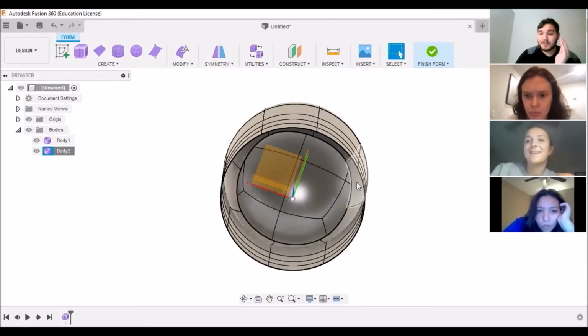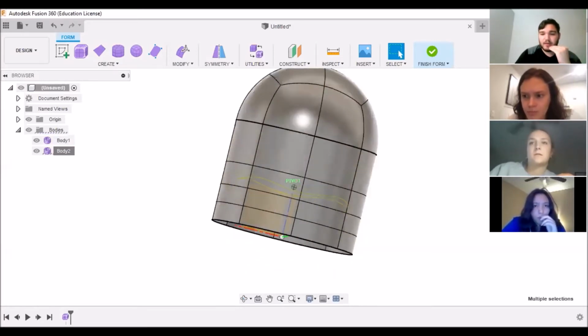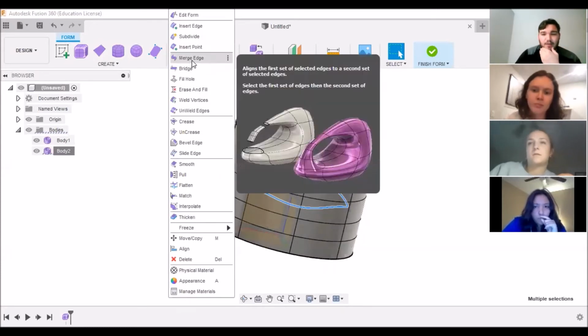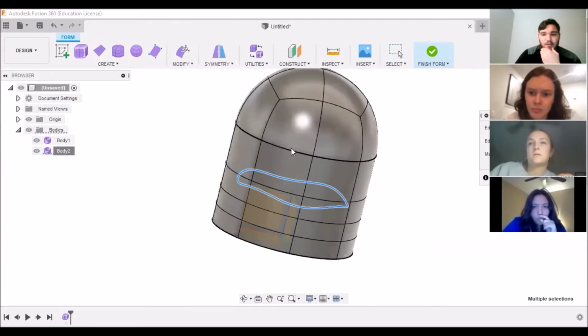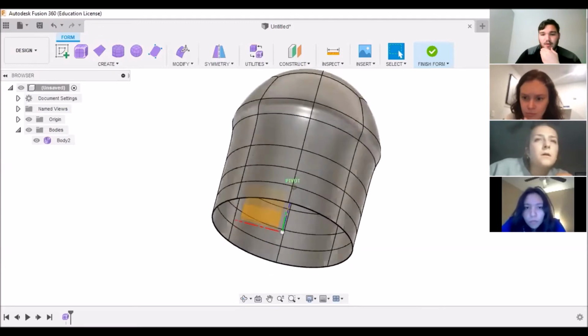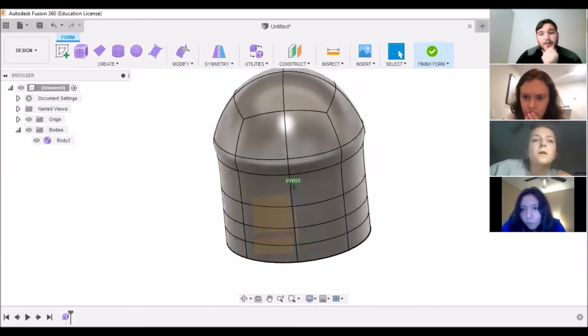To where if you wanted to, let's say the entire bottom half is completely removed. You can connect that circumference, modify, and I believe it's merge edge, to a second edge. Let's say it's that one. Press OK. And then those geometries have now come close together.